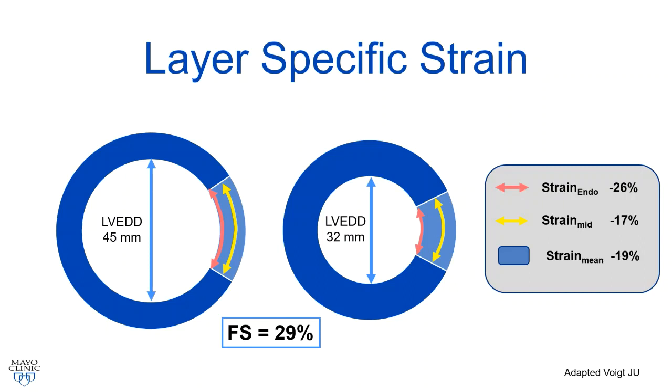Conceptually, though, full wall tracking using all the available features of the wall should result in the most robust longitudinal strain estimates. And in fact, the vast majority of available echo strain literature is based on full wall tracking.